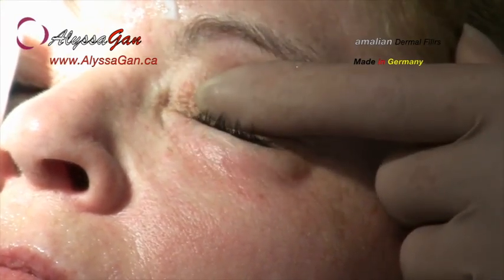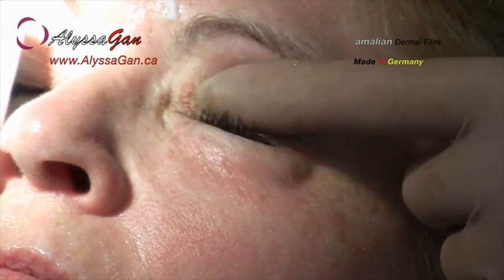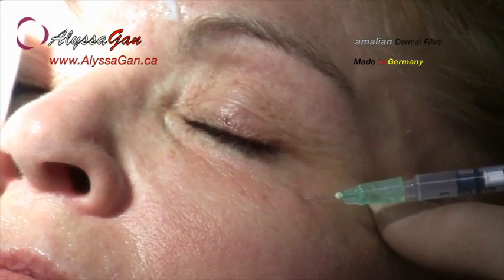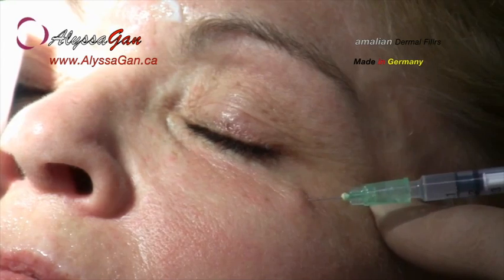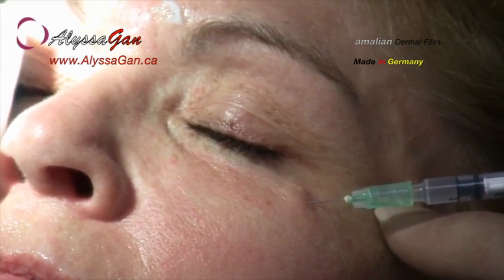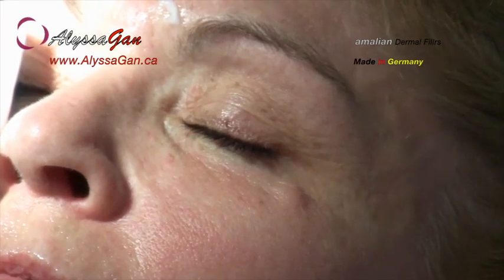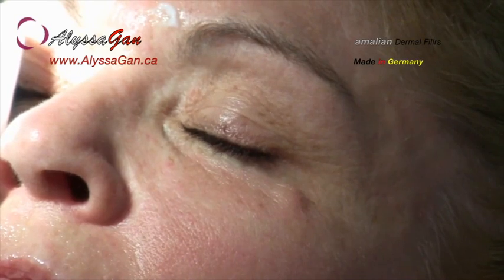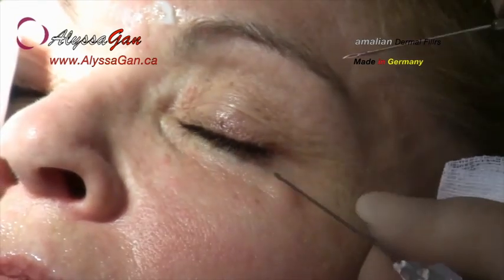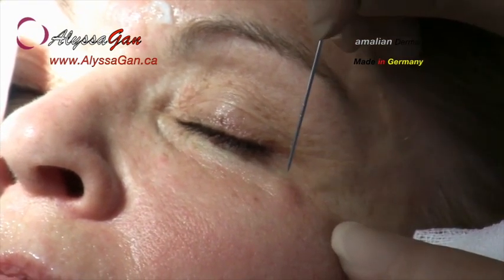Again, the physician verifies the correct position of the marked injection site through pressure onto the eye. As on the other side, first anesthesia is performed using a very thin 32 gauge needle. The anesthetic is lidocaine without adrenaline. The effect can be seen immediately. It is important to insert the preparation needle at the angle also intended for the subsequent tunneling.